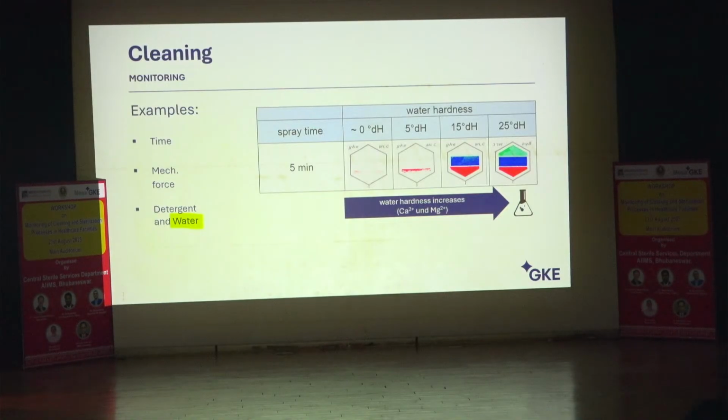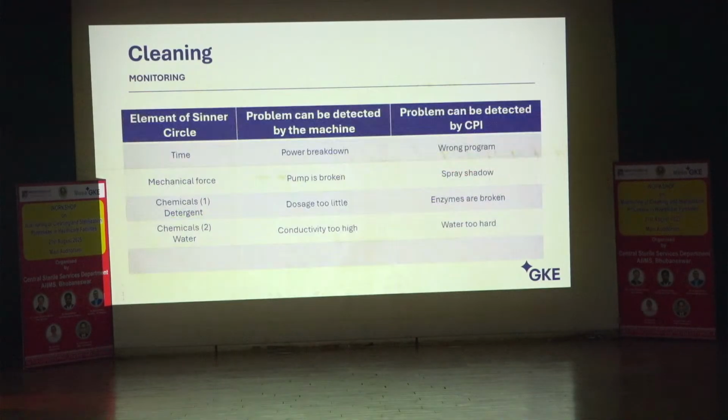This is very common in machines where you have to refill the salt to refresh the softening unit. This is the same technology like in a very trivial dishwasher where you have to refill salt. If this is not done regularly, the water will be hard and the cleaning effect will be poor. And this can be made visible with that.